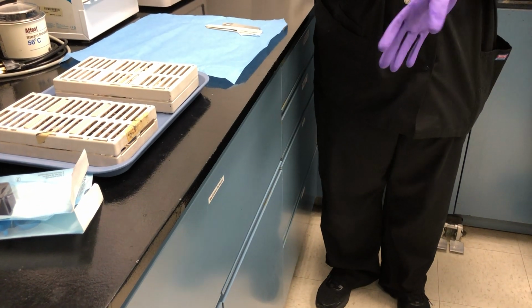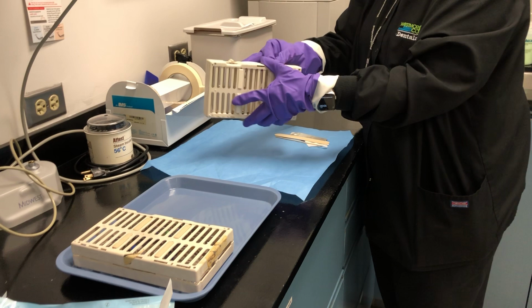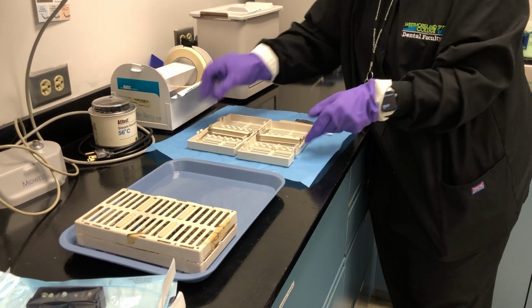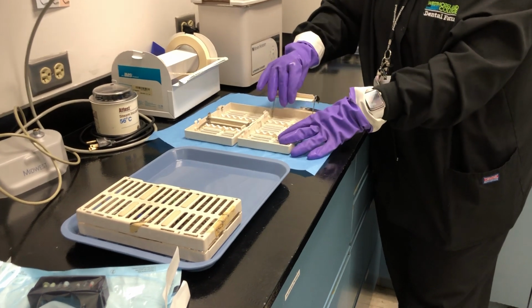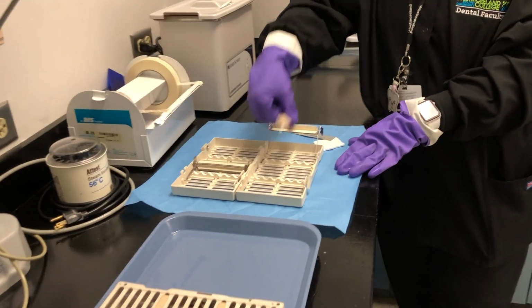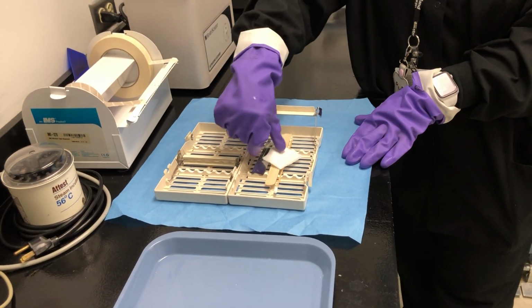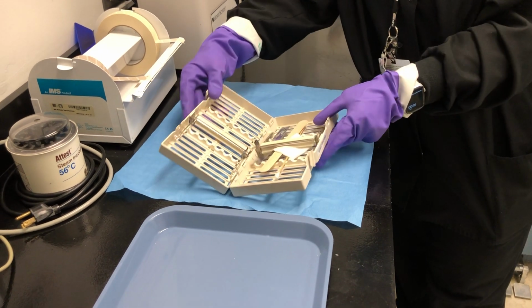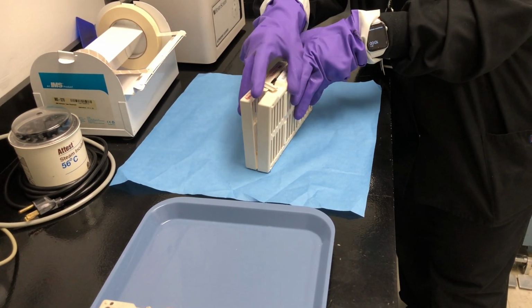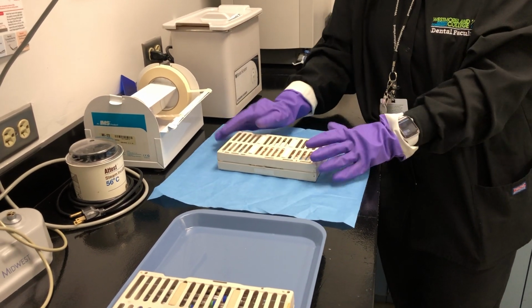So what you'll do, you put your glove back on. This is where you're going to open your tray, your cassette. You're going to peel back just one side because we want to put these things underneath the bracket so they don't kind of move around or fall out. And then we push down our bracket and we go ahead and put this together until it's locked again. And then our cassette is ready to be wrapped, okay?